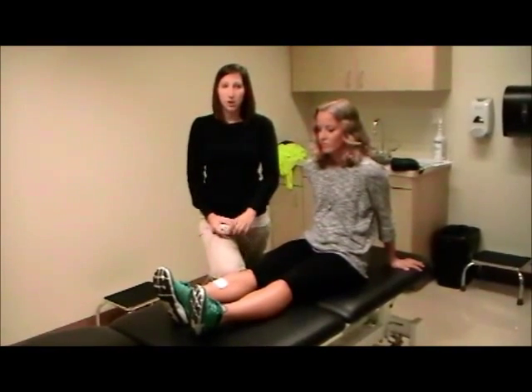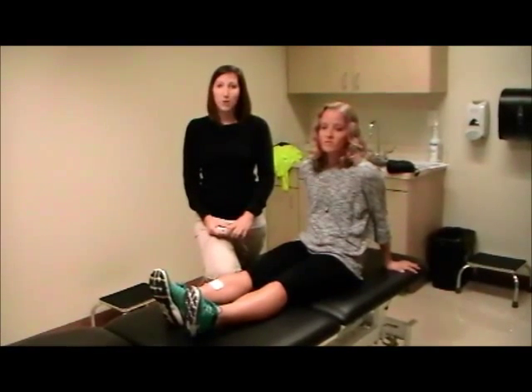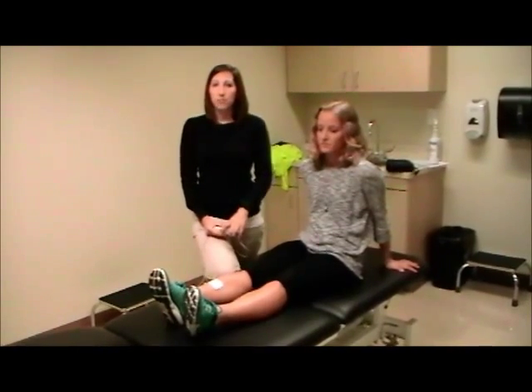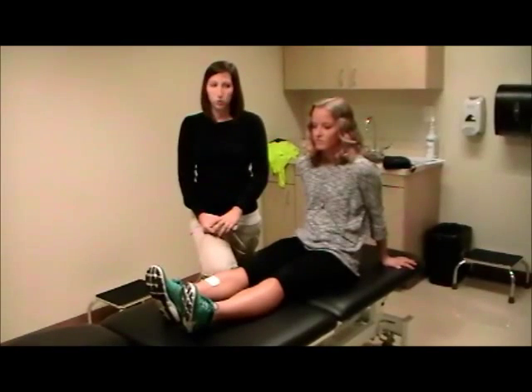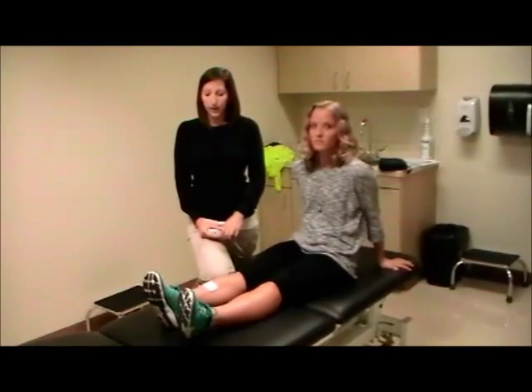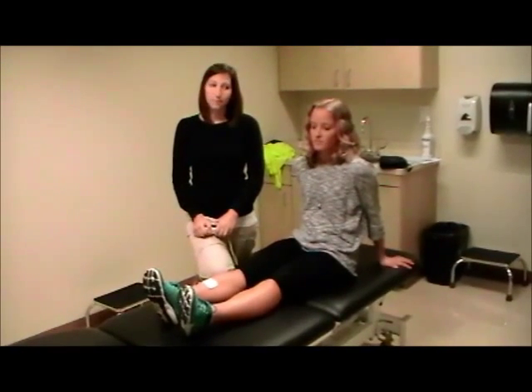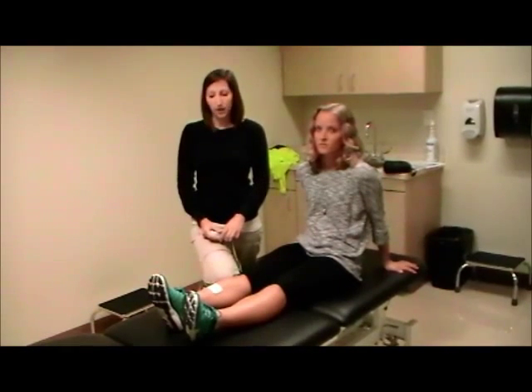It uses a biphasic rectangular waveform at a frequency of 35 Hz and a pulse amplitude of either 40, 60, 80, or 100 milliamps, depending on what it takes to dorsiflex the ankle to neutral. The pulse duration is also variable from 0 to 250 microseconds in order to dorsiflex the ankle without pain. The duty cycle is 6 seconds on and 20 seconds off.